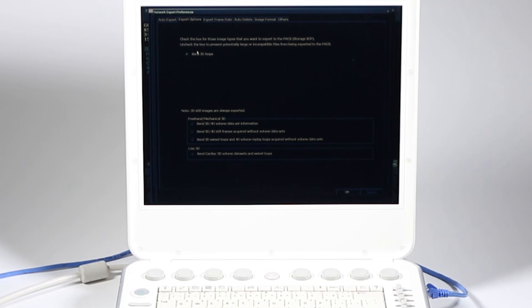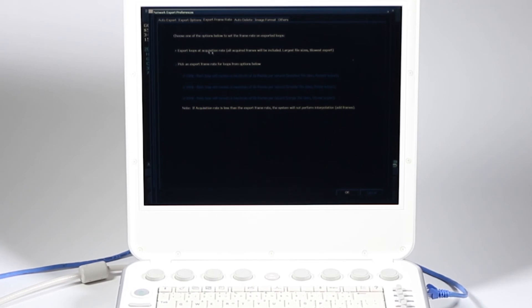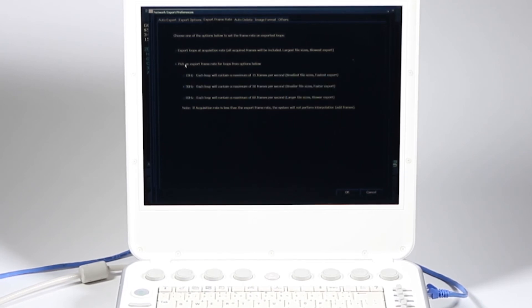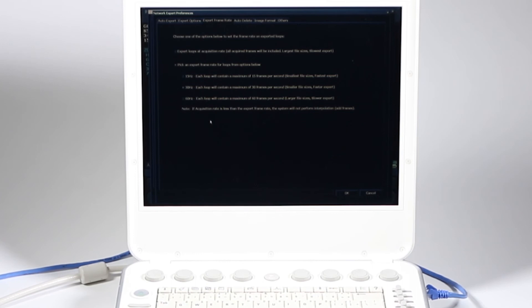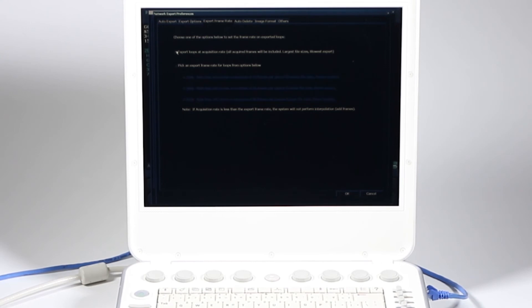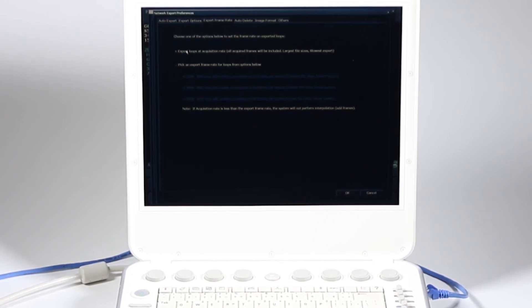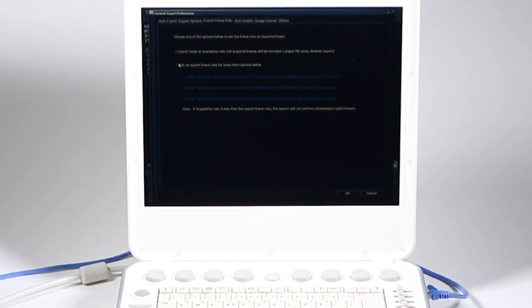Next tab over is called export options right here. Do I want to send 2D loops and 3D? Chances are you're going to leave that the same. Export frame rate. How do you want to export it? Do you want a specific frame rate to lower the size of images and files you go over? If you acquire a lot of loops, this will make for a much faster export when you go over the network. Full size is going to be slow. If you're on a fast network and image storage isn't a problem, it's no big deal. Talk to your IT or PAC server to find out what's best there.